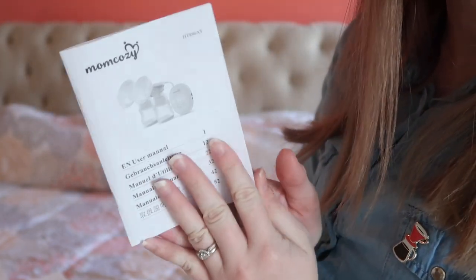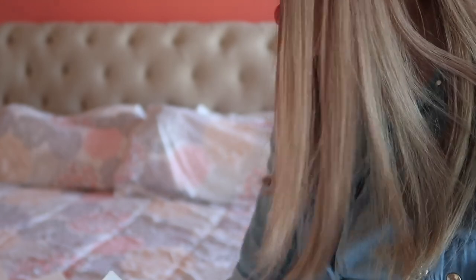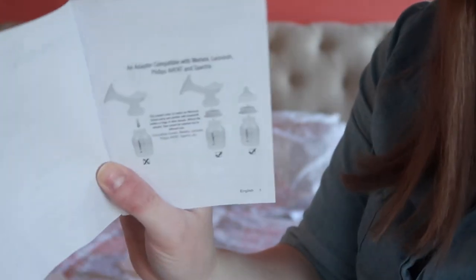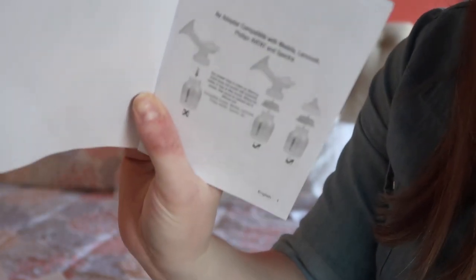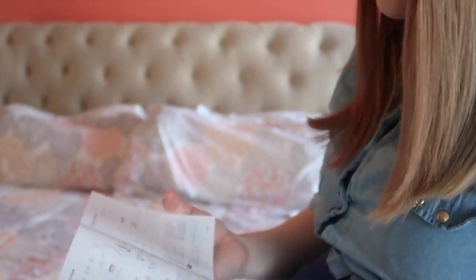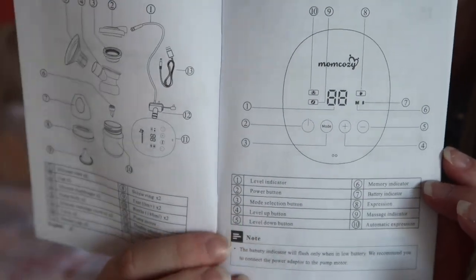It also comes with a manual. And I realized after fiddling around that these are actually adapters compatible with Medela, Lansinoh, Philips Avent, and Spectra, so they make it possible to pump directly into those bottles if you want. I think that's really cool — I didn't even realize that came with this. The manual tells you all of the parts and all of the functions.